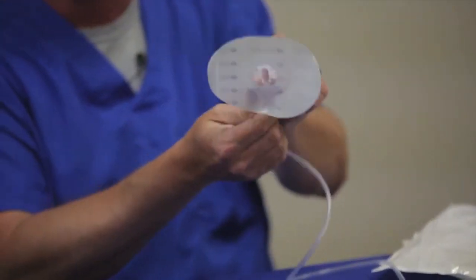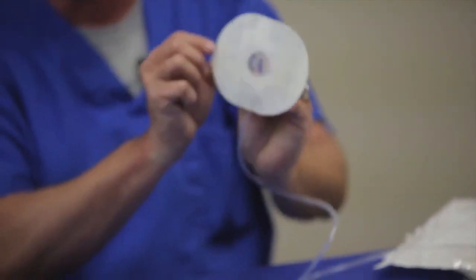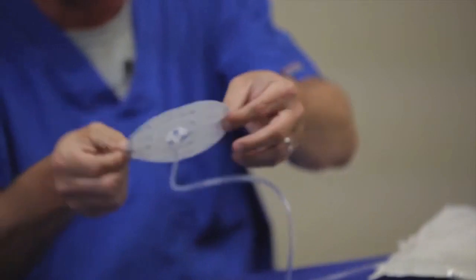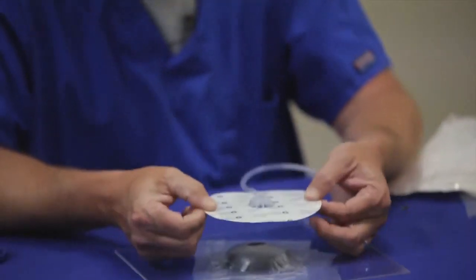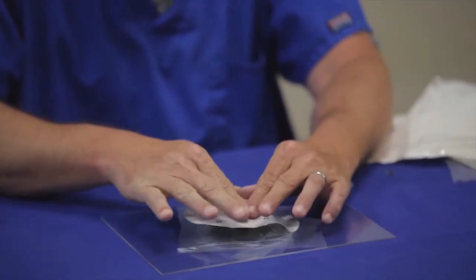Some practitioners prefer to grab it on the port pad. That's what the tabs are here for too also. You can take it down, look through the port pad, and line it up over the now previous cut hole. Then apply the drape.